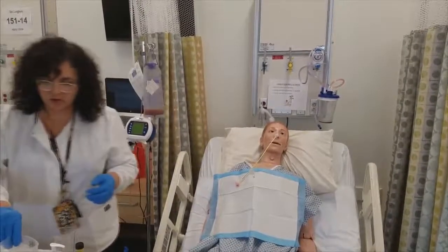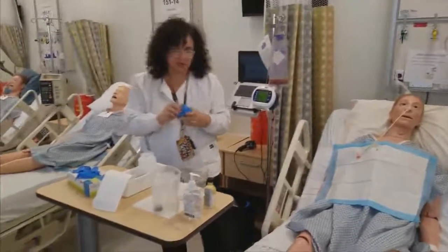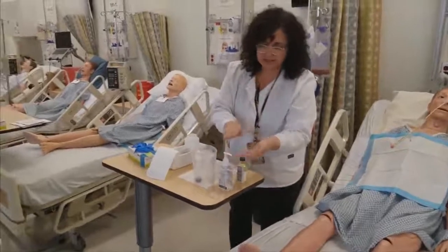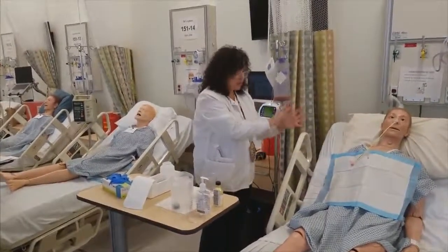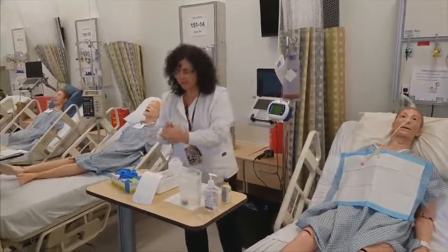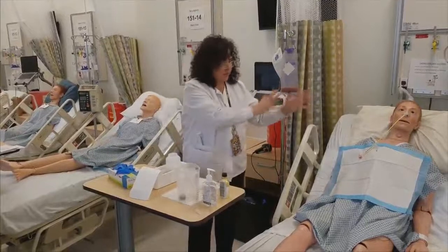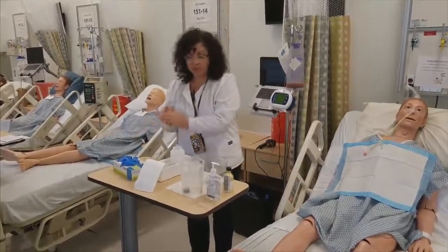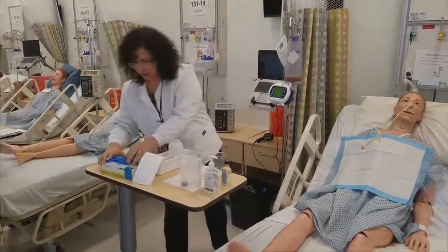Okay, so moving over here, I'm going to have a glove change, and I am going to wash my hands because I want to move from a little bit more of a dirty procedure to a clean procedure. So for infection control principles, when I switch from checking GRV and so on to prepping my meds or preparing tube feeding, I always want to insert a glove change and hand wash.